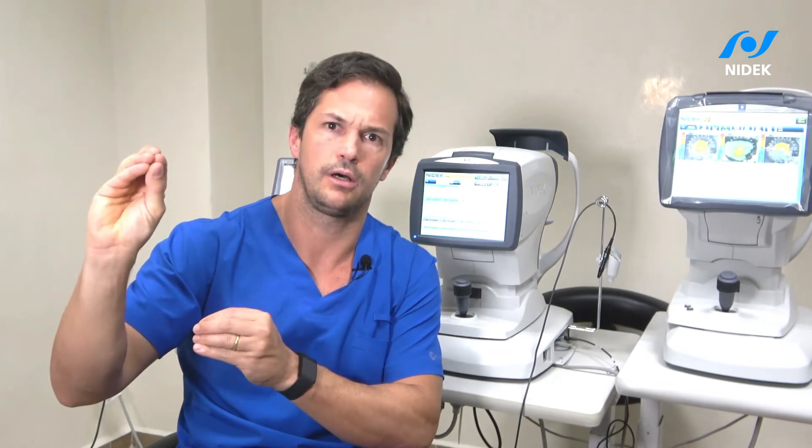I think it's a machine that is reliable. It will give you the possibility to individualize each patient, do a correct characterization of the outcome of the laser, and it will give you a map so you don't lose track of how many laser spots you're doing. I think it's a machine that I will use in every single patient I have.